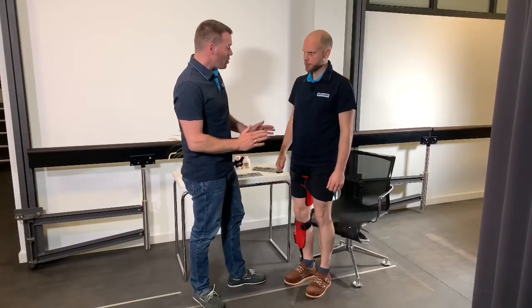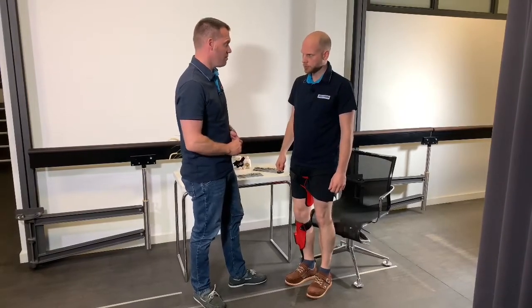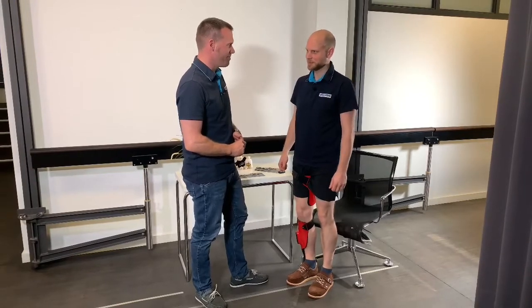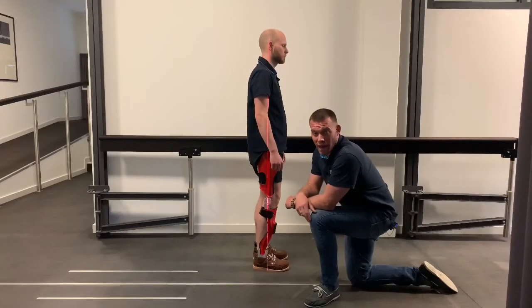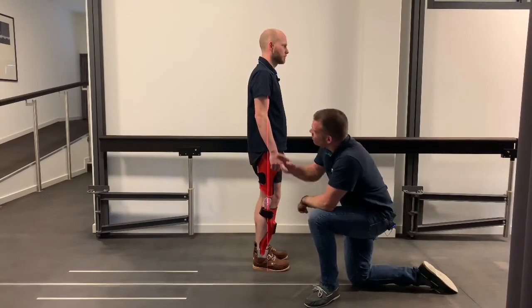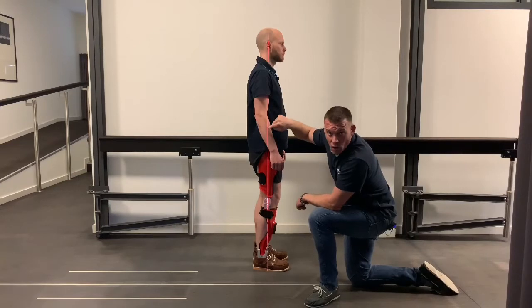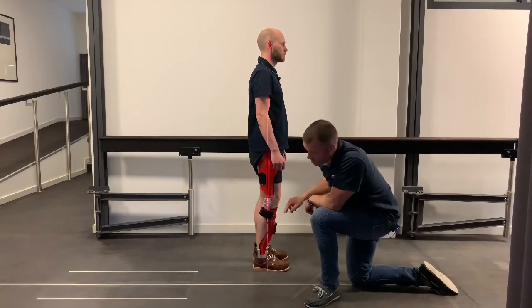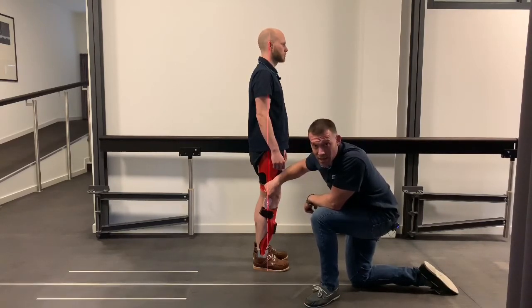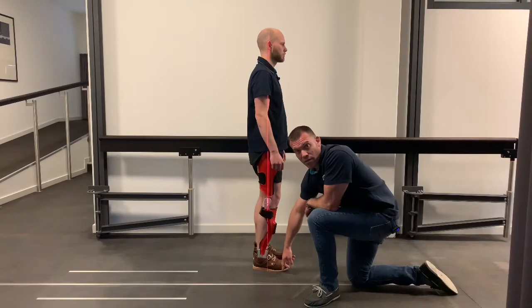The first impression is not so bad, but we want to have a look in detail at how the orthosis is aligned. It feels safe. I dimmed the light a little bit for the following steps so you can better observe the laser line. We see the plumb line running through David's hip joint, through the mid-AP at the thigh, definitely in front of the mechanical axis of the knee joint, in front of the ankle joint, in the back third of the front half of the supporting surface.